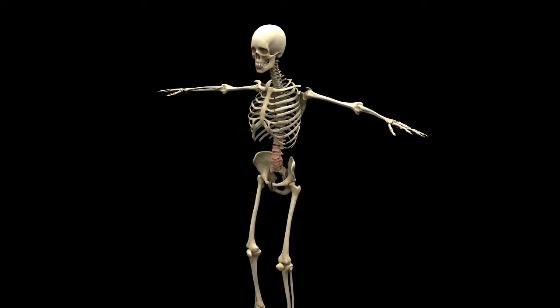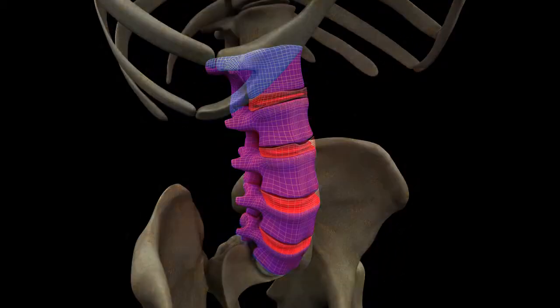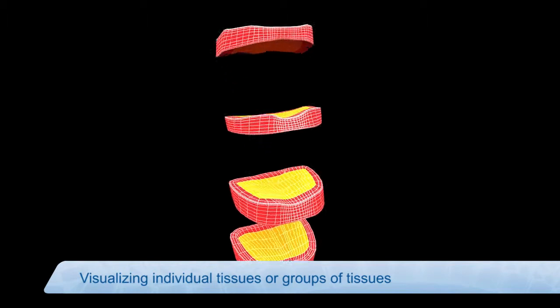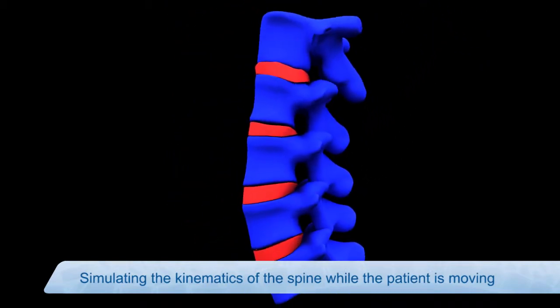Next, a biomechanical analysis is performed to predict the load transfer onto the discs and vertebrae. The evolution over time of the possible degeneration of the adjacent discs and of the remodeling of the vertebrae is simulated. Several clinical scenarios are considered.